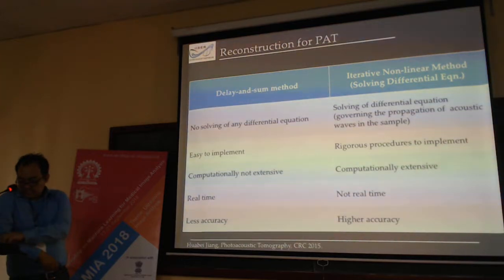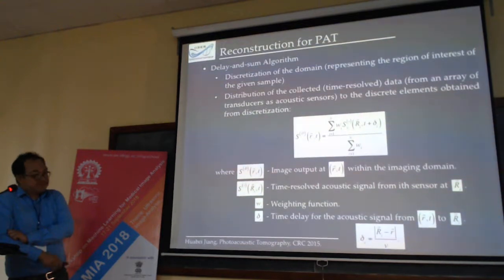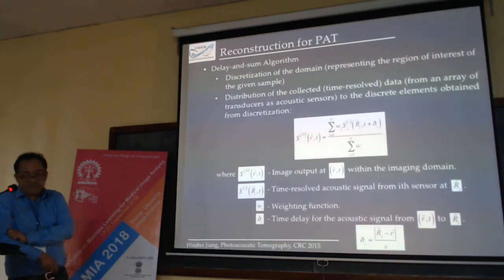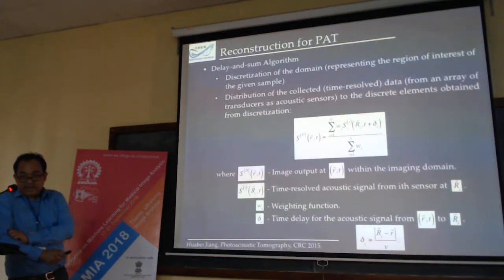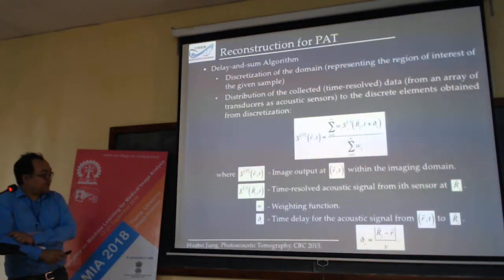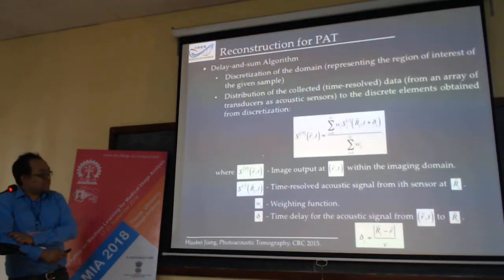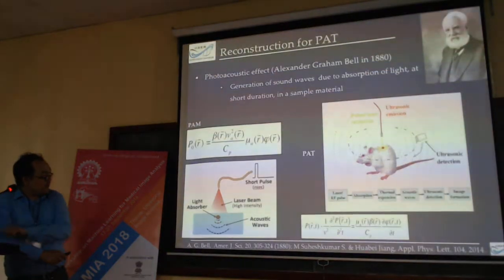So I would like to discuss this delay and sum technique. The whole theory of delay and sum is given by this equation. The signal is collected by a detector or an array of detectors kept around the sample, and that is used to construct the distribution of the signal in the domain.